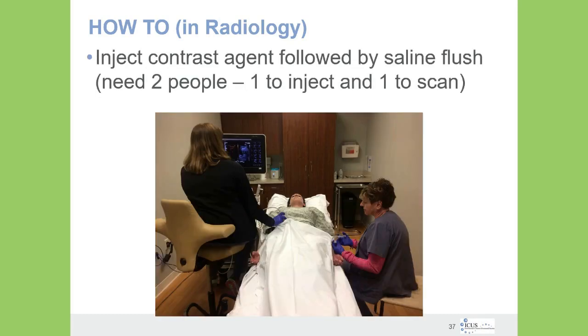We need 2 people to inject and scan during an ultrasound contrast examination. It is nice to put the IV in the left arm because that way that side of the bed is for the person injecting and the patient's right side is for the person scanning.